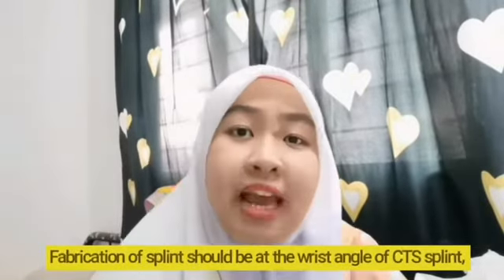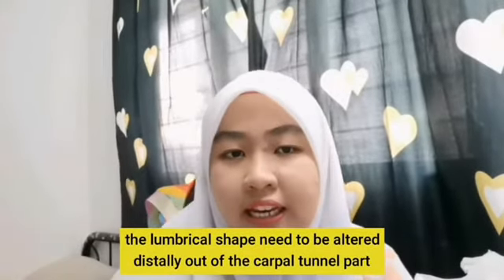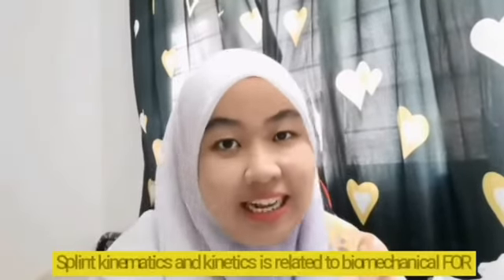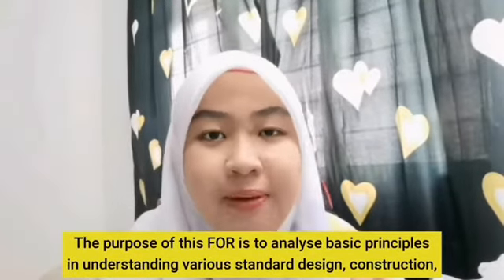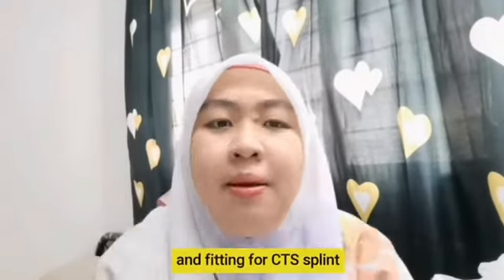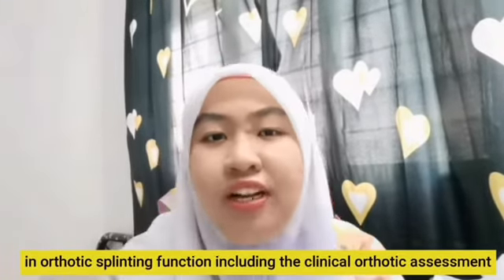Fabrication of the splint should be at the wrist angle of the carpal tunnel splint. The rhomboid shape needs to be altered distally out of the carpal tunnel part in order to decrease the pressure at the median nerve. Splint kinematics and kinetics is related to the biomechanical frame of reference. The purpose of this frame of reference is to analyze the basic principles in understanding various standard designs, construction, and fitting for CTS splints. Biomechanical orthotic splint application requires a specific understanding of orthotic splinting function, including the clinical orthotic assessment.